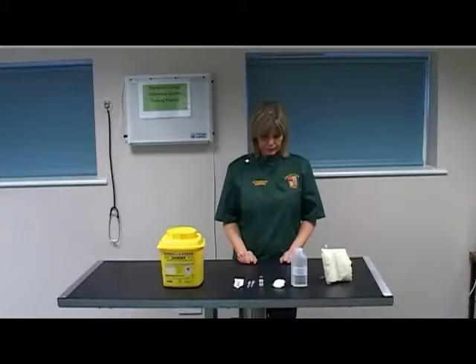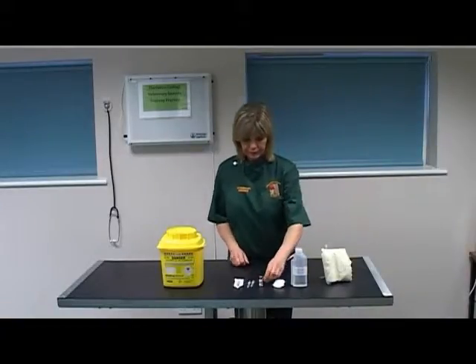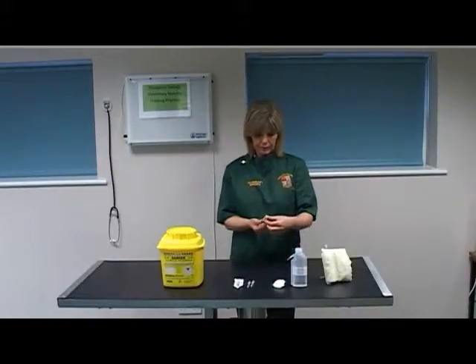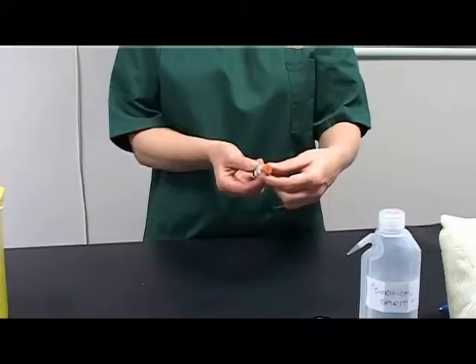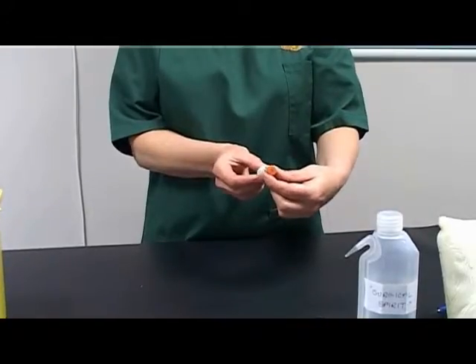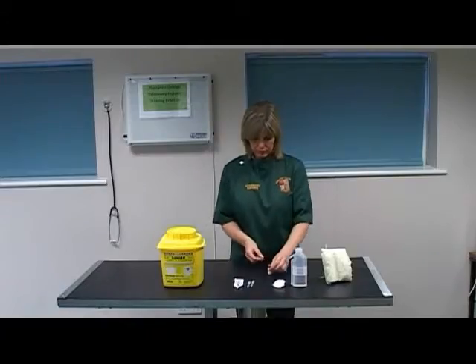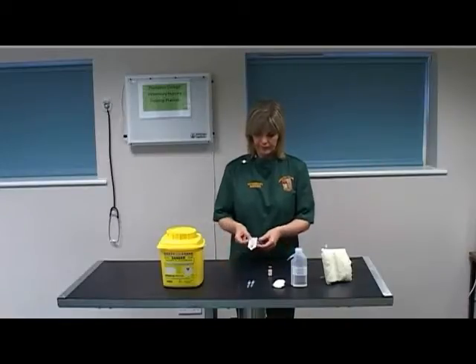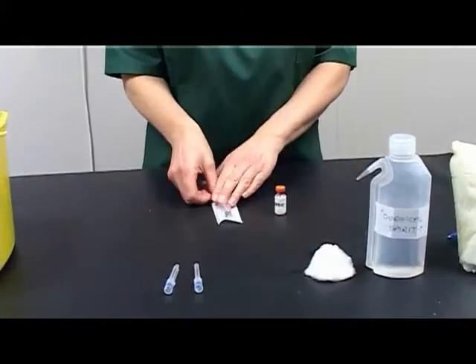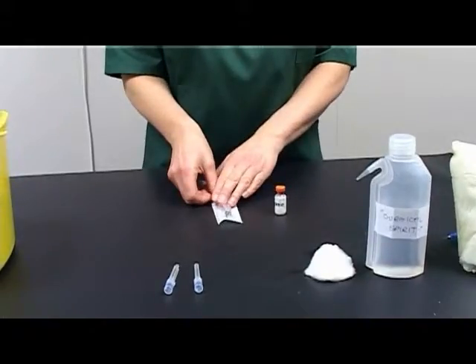Select the correct Vetigesic vial. Check the expiry date and date of first opening — this needs to be within 28 days of opening. Select an appropriate syringe; 1–2 mls depending on the dose would be suitable.